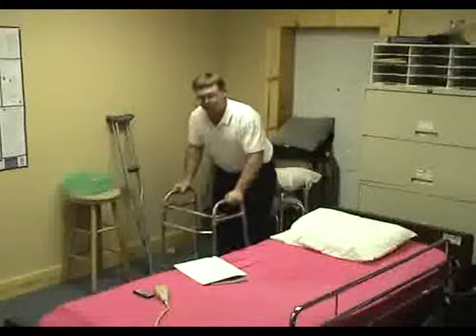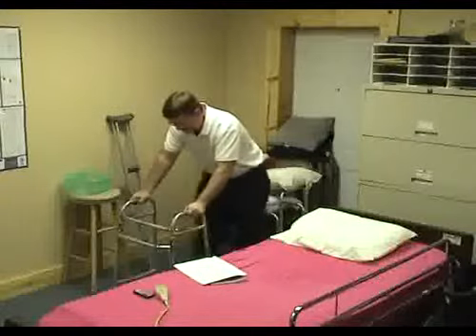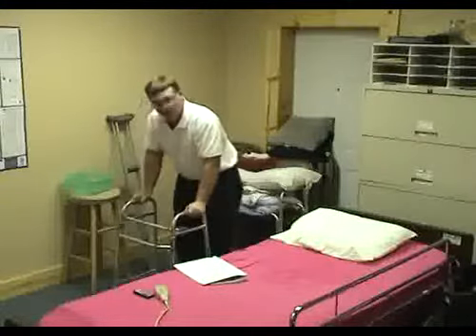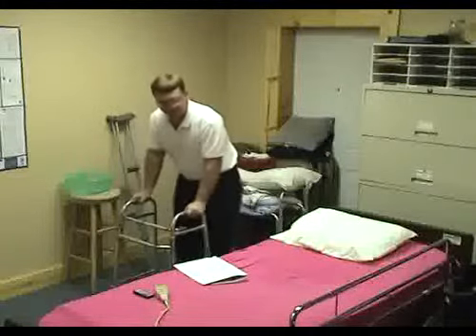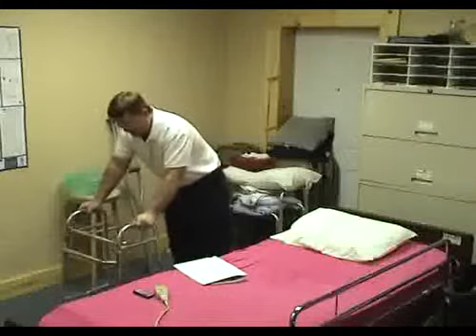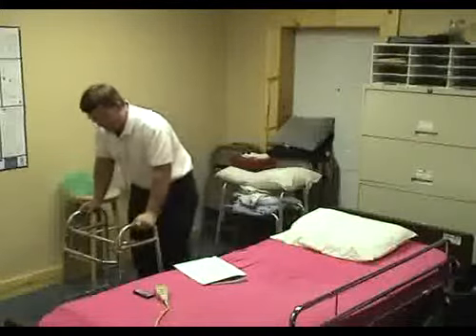You want the walker to go first, and then the patient to step up to the back of the walker. That way, it's not going to tip. Walker goes first, step up to the back of the walker.